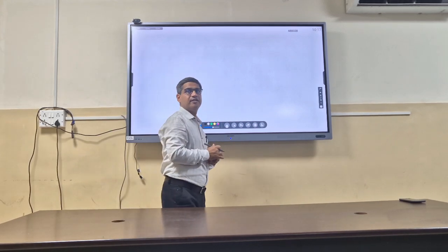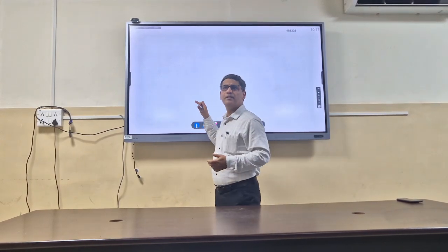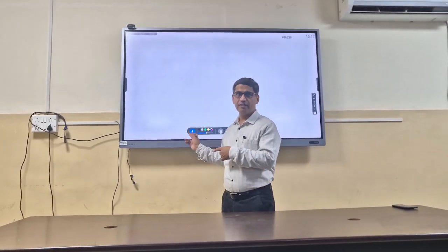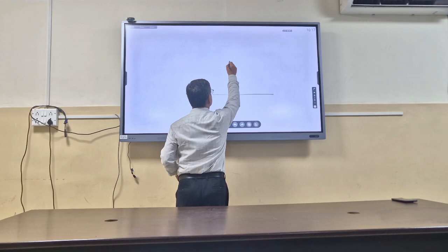In the last lecture, in the pure tone audiogram, the graph was plotted between frequency on the x-axis and intensity in decibels on the y-axis. Now here again there are 2 axes, so the graph is plotted on the x and y-axis like this.